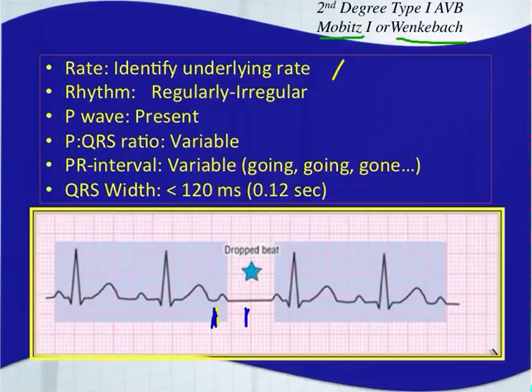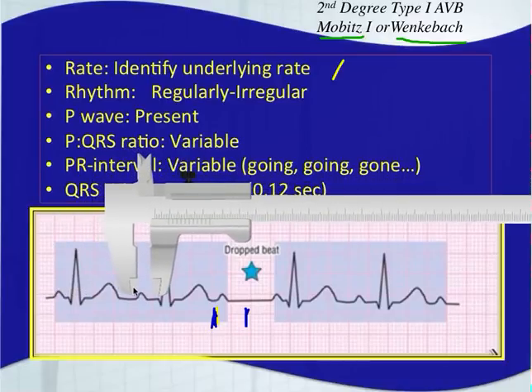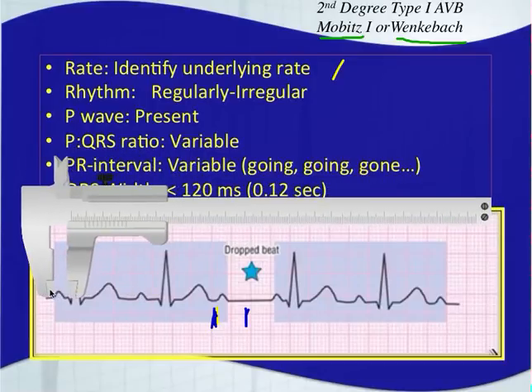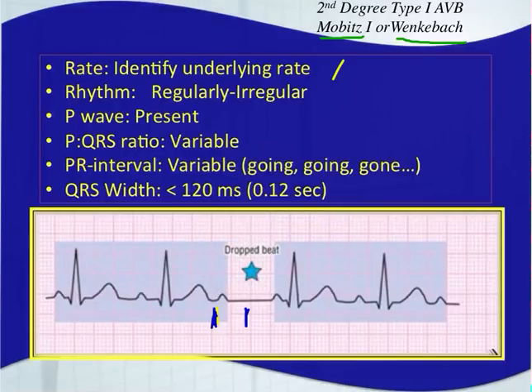The pattern that makes this a second degree type 1 is what we call 'going, going, gone.' The PR interval gets longer from one beat to the next — going, going, gone, then no QRS complex. It could be going, going, going, gone — over three or four beats before you have a dropped beat. That's typically the pattern to remember. The QRS width should be narrow, less than three small boxes wide.